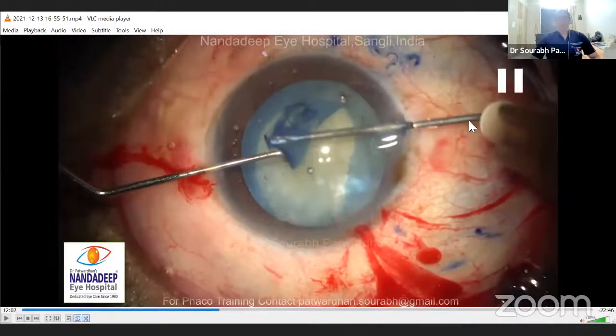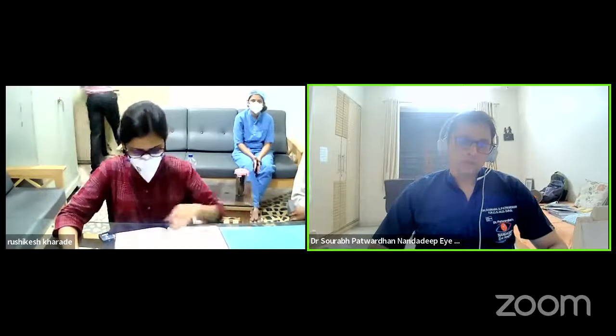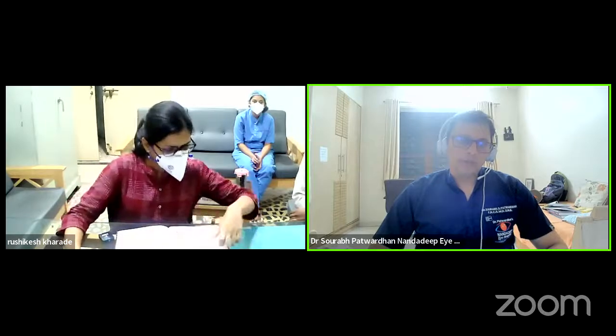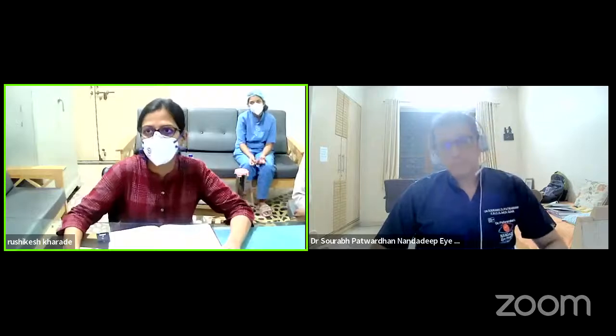Okay, so this was, I think, well rescued after the initial outward extension. Yes. Yeah. So you have any other case to share? Yes, sir. There was one soft cataract.